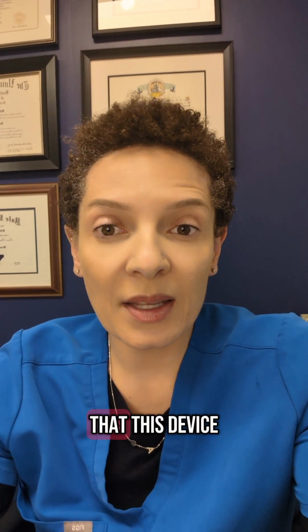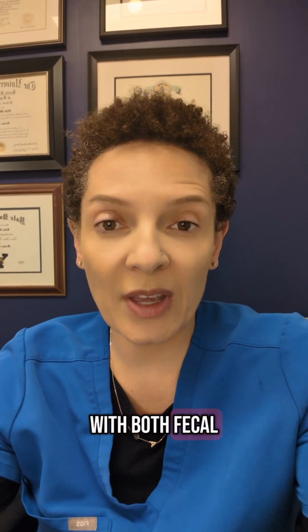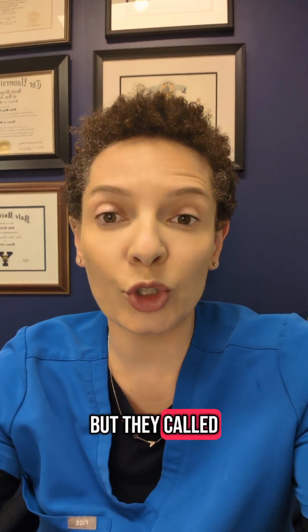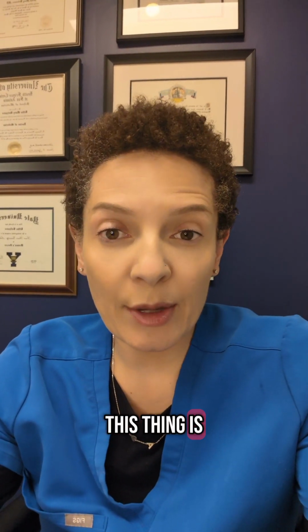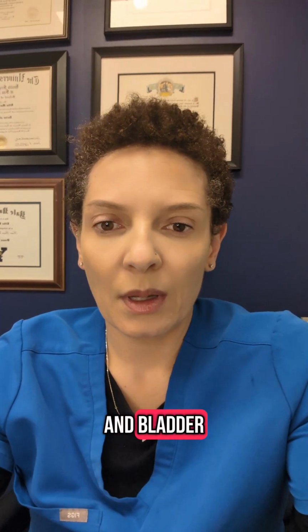Now, before I show you the device, I just want to let you know that this device can be used to help the same person with both fecal and urinary incontinence. So in somebody that has both, what they call dual incontinence, this one device will work for both of those issues. Now, just so you know, this thing is an implant. So that means it goes inside of your body, under your skin, and it stays there. It kind of looks like a pacemaker, and it essentially is a pacemaker for the bowel and bladder.